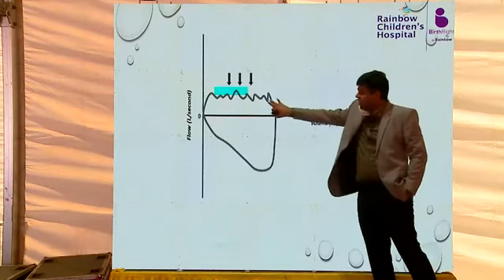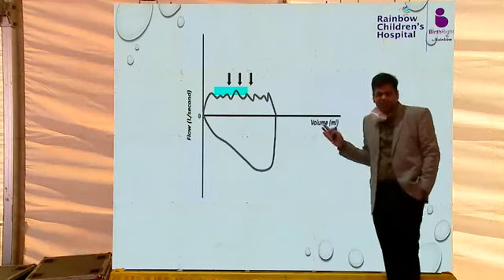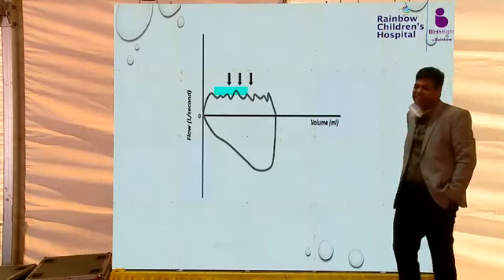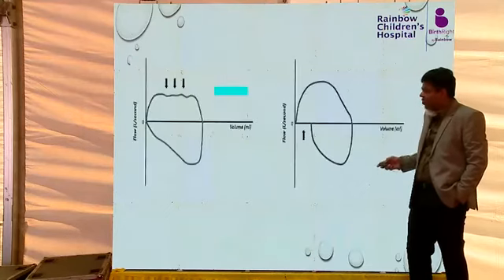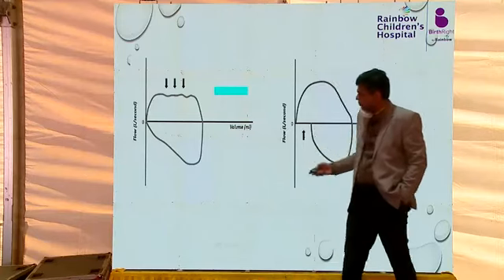It's like this. When there is this in the inspiratory part, this is because of any guesses? Very nice. Excellent. So water in the tube will lead to this. Okay. Anything which is happening here?